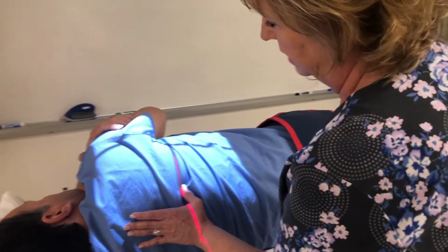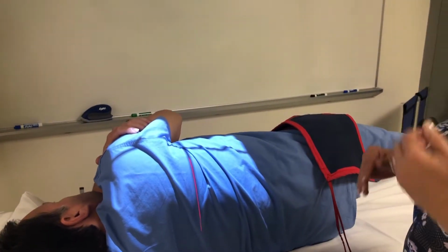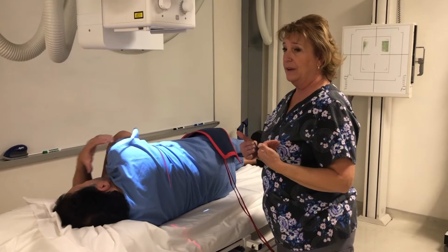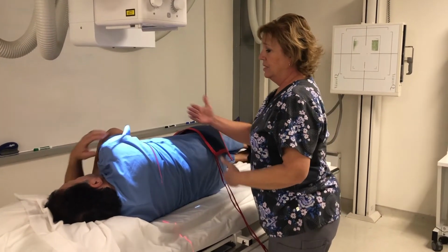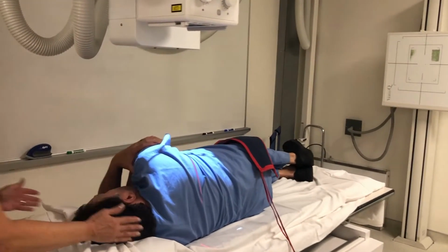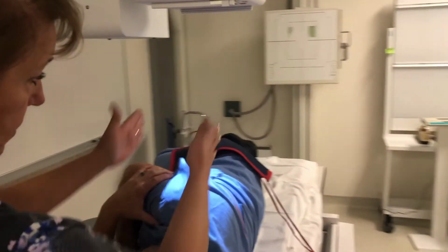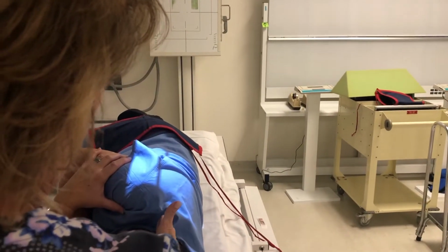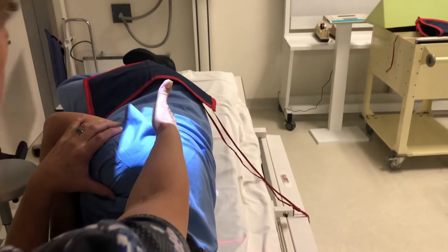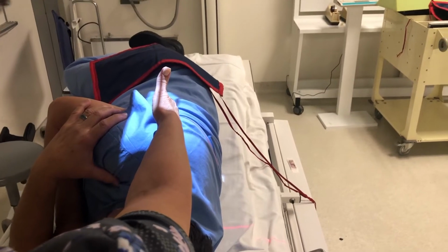So we're centered. Now, your book talks about centering along the posterior half of the thorax. So if you're on mid-coronal plane, which you find by making sure that shoulders and hips are in the same plane, I'm looking at the mastoid tip. Right now I'm on his mid-coronal plane.